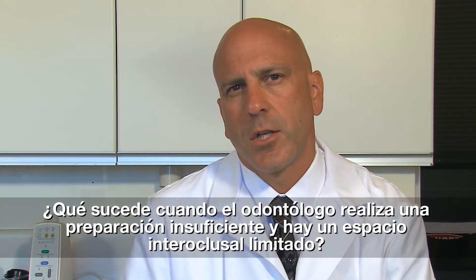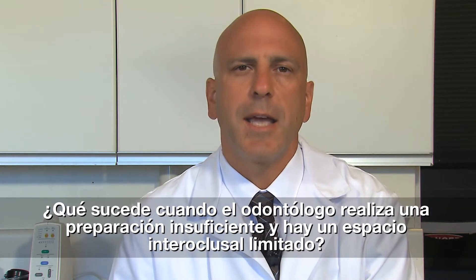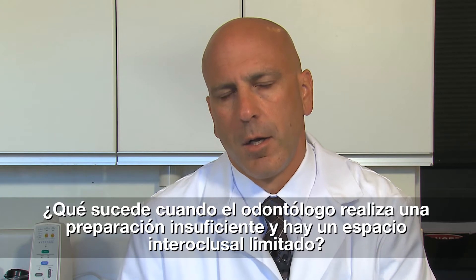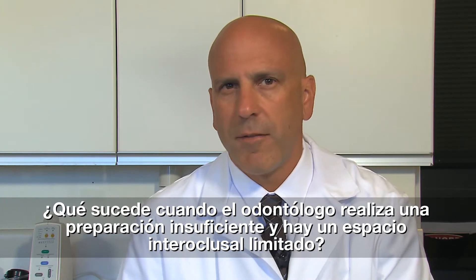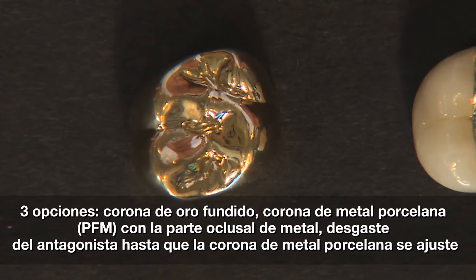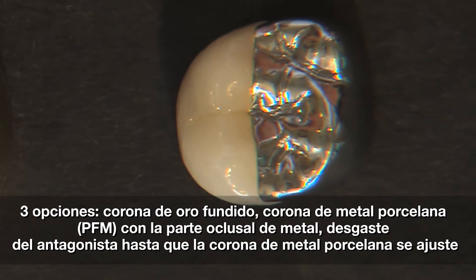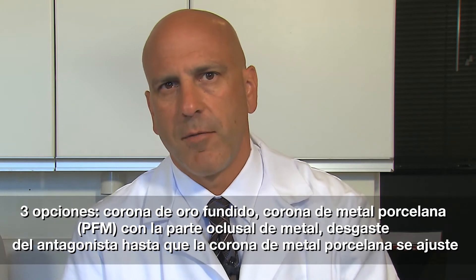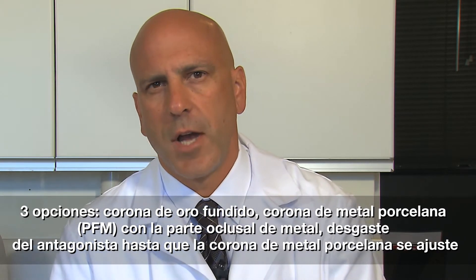Another reason why a Bruxer monolithic zirconia crown is such a good idea is because we see a lot of cases here in the laboratory where dentists have had to underprepare — for any number of reasons — and in those cases we have very few choices. The choices typically come down to: you can do a cast gold crown, you can do a PFM crown with a metal occlusal, or you can adjust the opposing until this PFM fits between it. Now all three of those options aren't necessarily attractive to the patient.